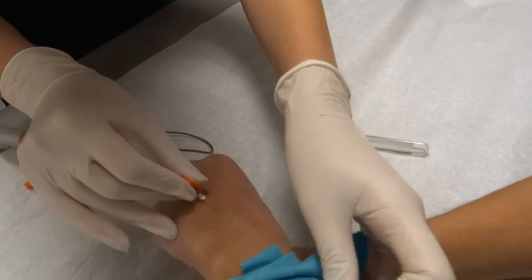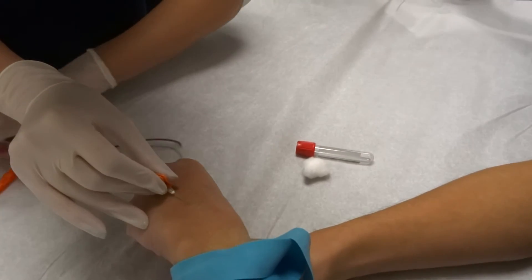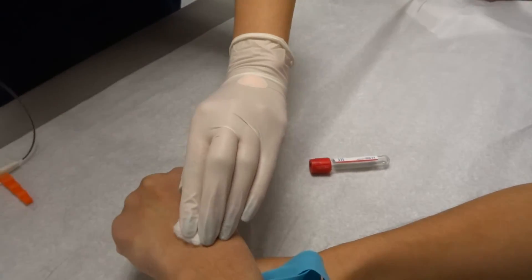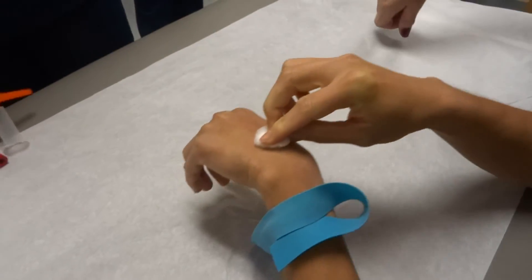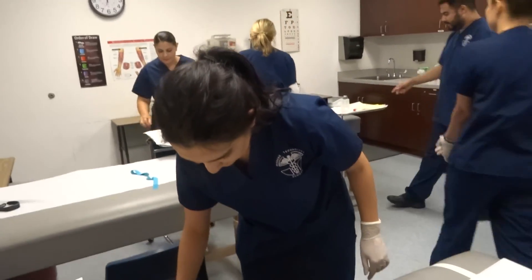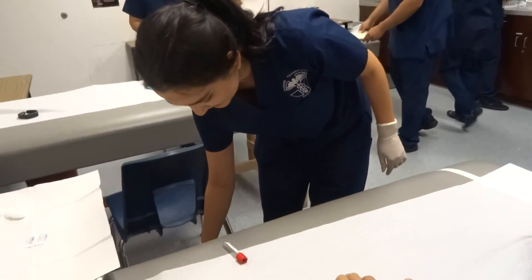So tourniquet, tube, and needle. Did you move? Excellent, Stephanie. Okay, pinch those bad boys. Up you go, just like that, and drop. Good job. Thank you. Be very careful. Thank you.